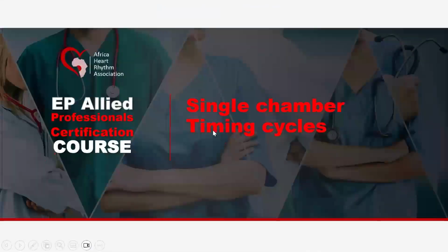Okay. So when we talk about a pacemaker, we talk about something like a counter. That means it's like a timer. So to understand how it works, we need to understand how this timer works.